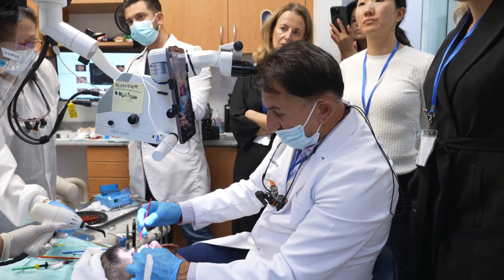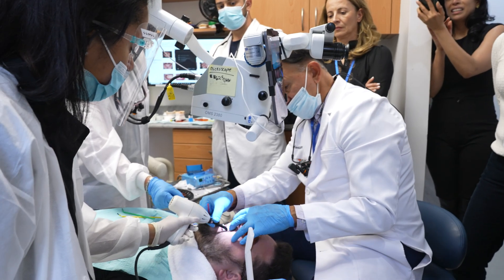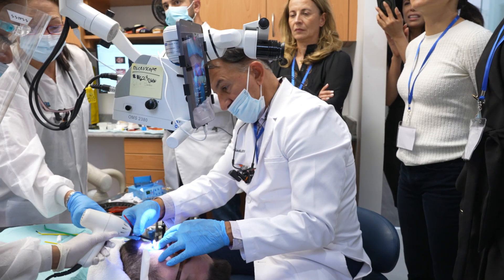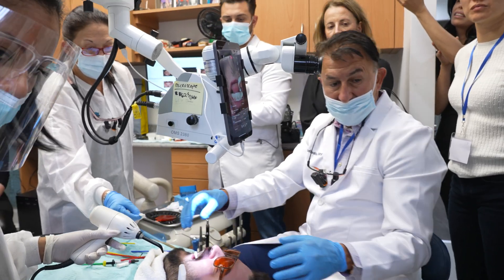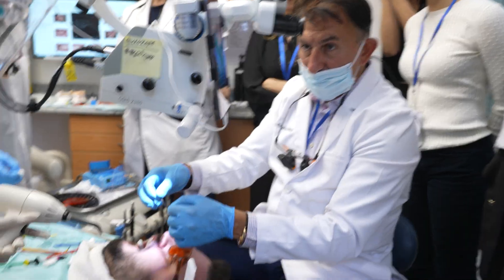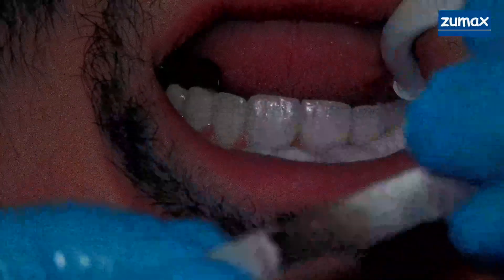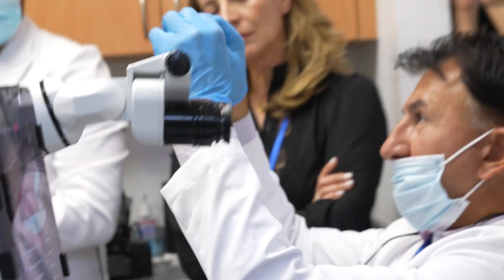This is Level 2 doctors watching the insert. Please, you've got to take Level 1 first — you can't just come to Level 2. So now I'm going to go in with the serrated blade from Brassler. This is about a 7mm one — I like the 10mm better, but that's the one I like. Make sure your serrated goes towards the lingual, so I'm pushing in towards the lingual.